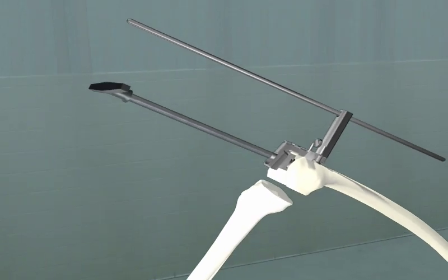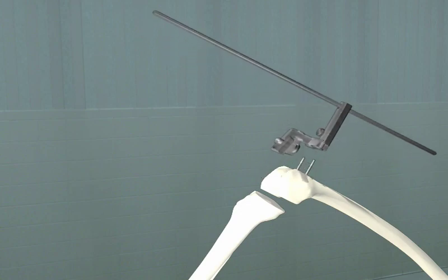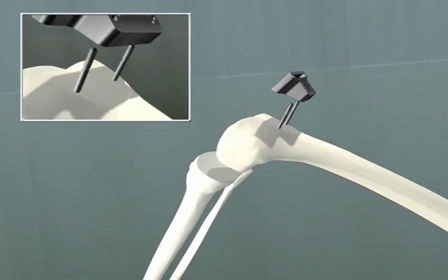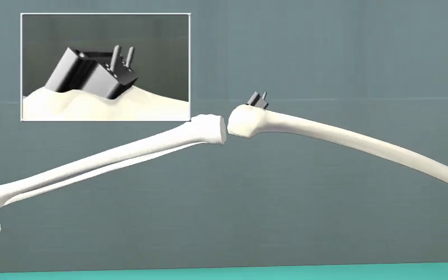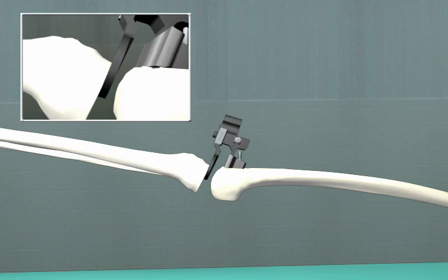The guide is removed from the pins, and the distal femoral resection guide is placed onto the pin surface. The distal femoral guide positioner is then placed into the inferior slot of the distal femoral resection guide and placed into the extended knee joint, making contact with the proximal tibia. This gap represents the same gap in extension as was determined for the flexion gap.